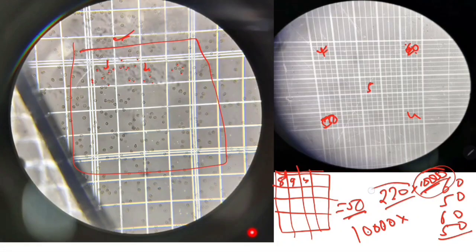10,000x. So whatever cell you get in total across all 5 boxes, just multiply by 10,000x and you will get the actual number of the RBC count. So that calculation now we'll learn. Why we should do 10,000x, that is important.